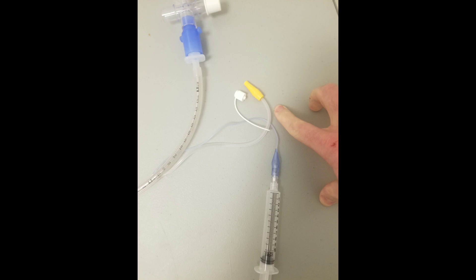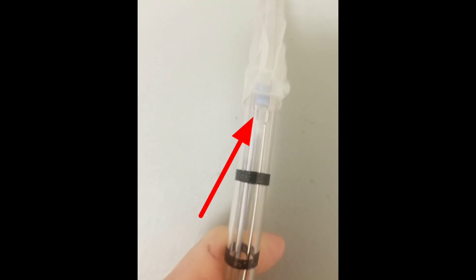So yeah, I just want to share what I do when I have to deflate the ET tube cuff. You know that there are evac tubes that have a suction port just above the cuff — a small orifice — you apply negative pressure to it and it suctions the secretions that are between the vocal cords and the cuff. This is used to help reduce ventilator-associated pneumonias.